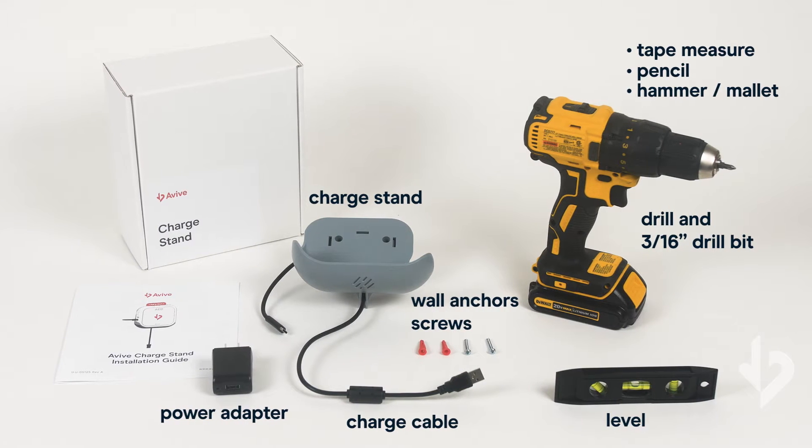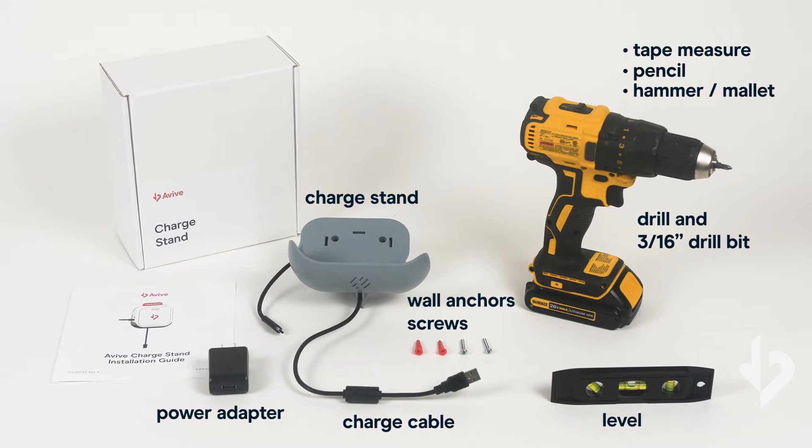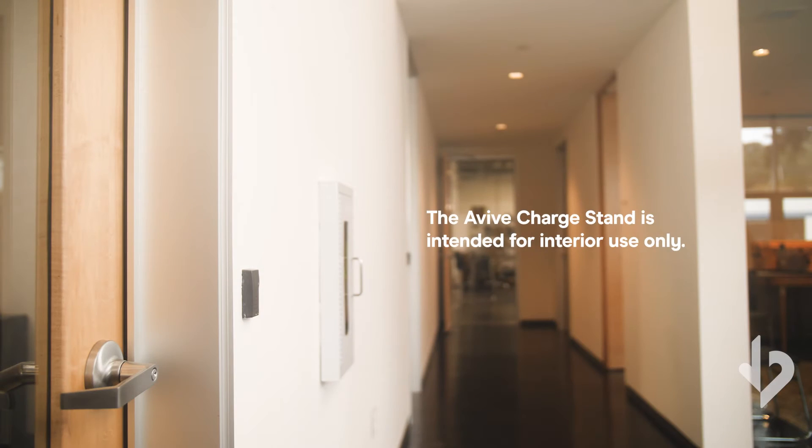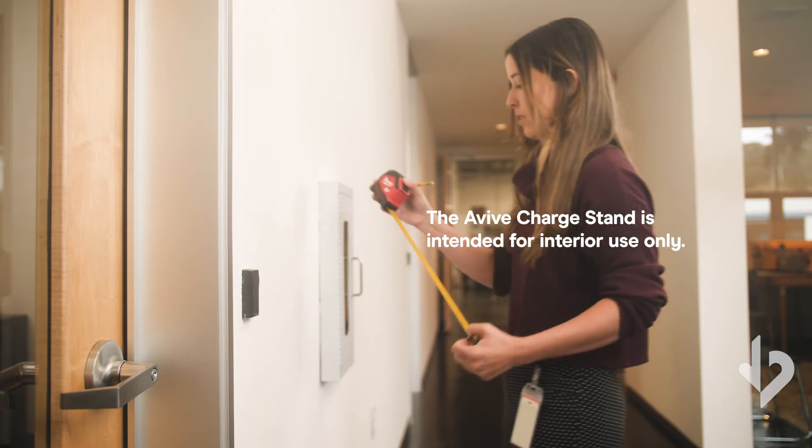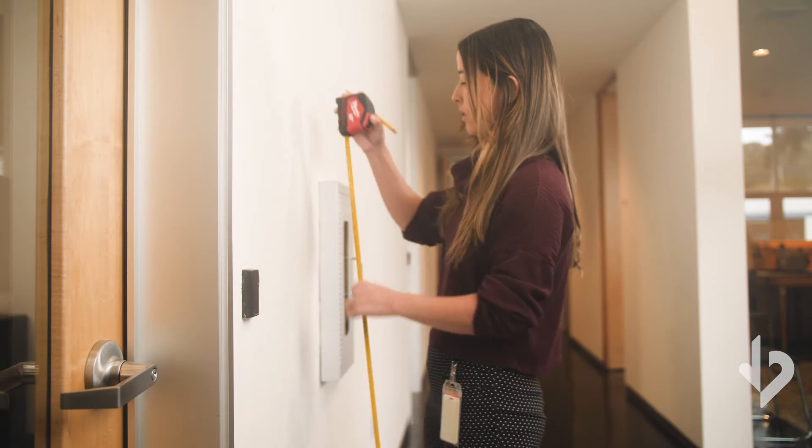Decide where you would like to place your Vive Connect AED. An interior wall in a highly trafficked, easily accessible area near an outlet is ideal.